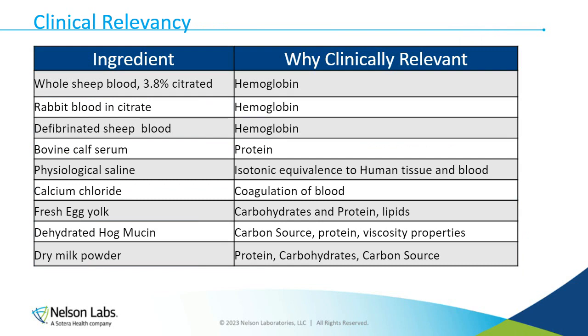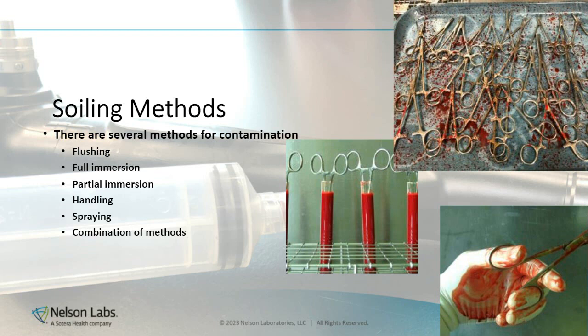This is very important to have, because this is how the clinical relevancy of the test soils has to be maintained and discussed in detail, right? It's important that we have what is used and how it is clinically relevant. FDA and any regulatory body would like to see that. So make sure you have this chart available.